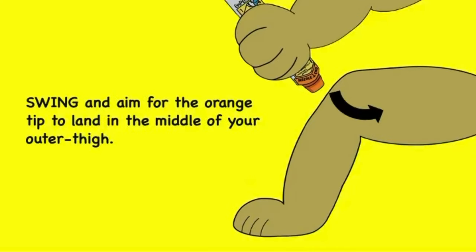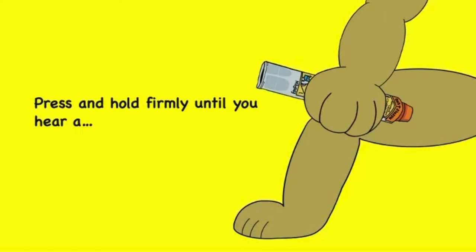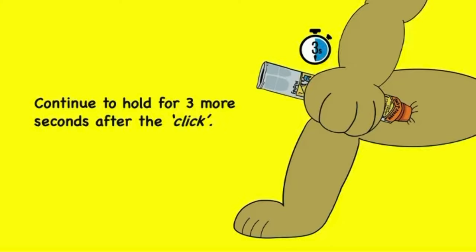Swing and aim for the orange tip to land in the middle of your outer thigh. Press and hold firmly until you hear a click. Continue to hold for three more seconds after the click.